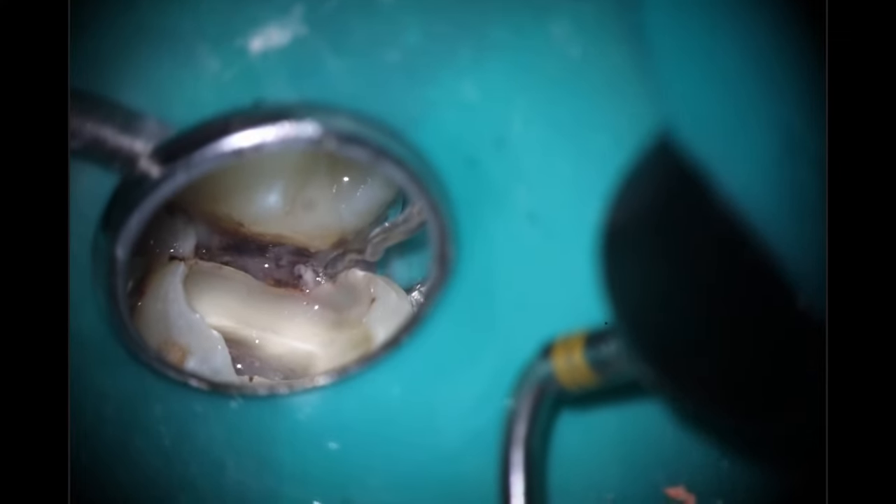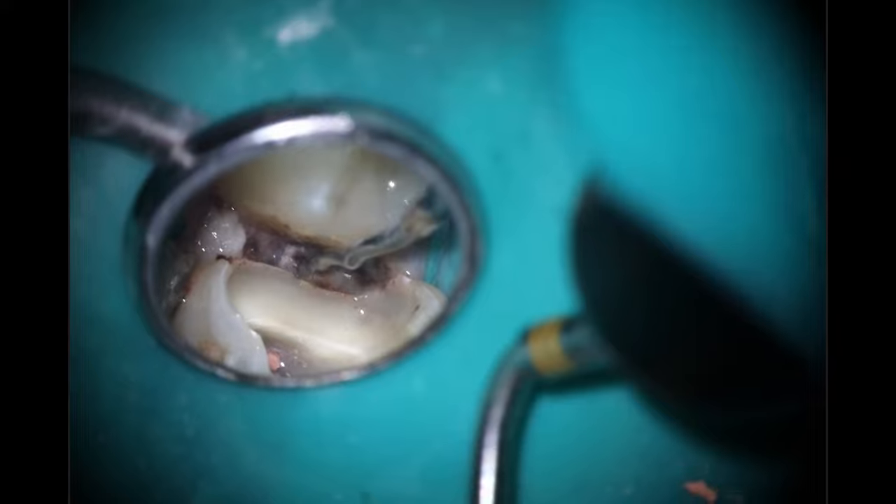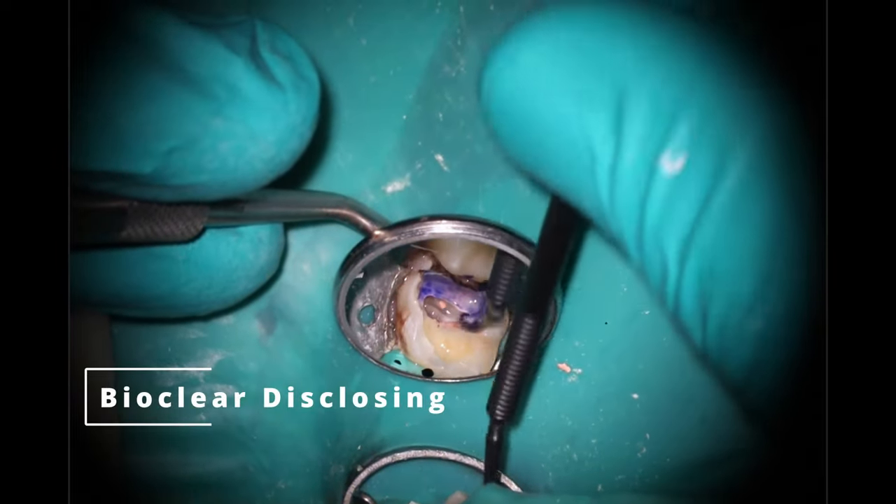I did the zoomed out version for you here, so you can see exactly how we do this process. At this point I'm looking at it, trying to figure out if there's any other bleeding spots. There's a little bit on the palatal, so we're going to get that nice and dry. Have you gotten out all the restorative stuff? Yes, I have all of that prepped and ready on the counter. Have you mixed the prime and bond? I have not mixed the prime and bond just because it does tend to set up, but I have everything prepped. The doctor has put in all of this work to stop the bleeding; we're prepped and ready to go so there's no excess bleeding after.